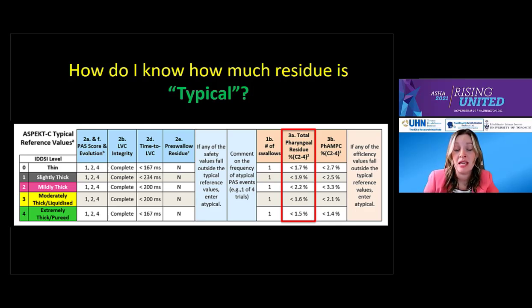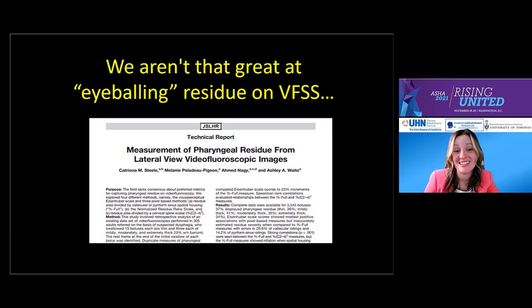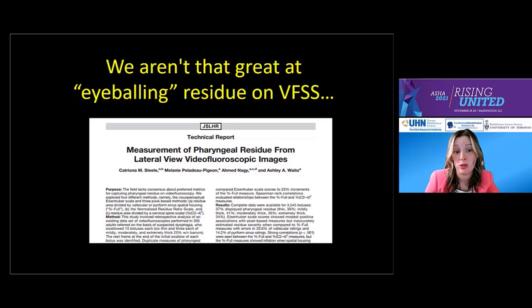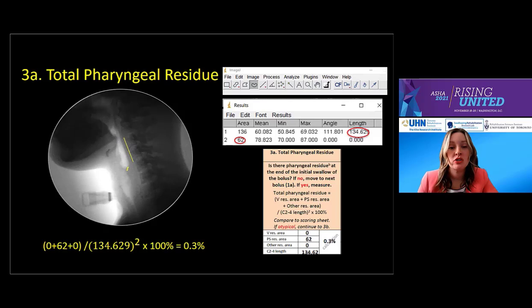Looking at the scoring sheet, anything less than 1.7% for thin liquids is considered typical under total pharyngeal residue. This number changes by consistency. You might wonder, how do I know what 1.7% of the C2–C4 squared space looks like on fluoro? The answer is: you don't, and neither do we. Even experienced raters who trace residue all day long struggle at putting residue amounts into ordinal boxes, even with generous 25% increments like the Eisenhuber scale. Based on a review of over 3,500 boluses, we suggest you trace residue — even if it's a small amount.